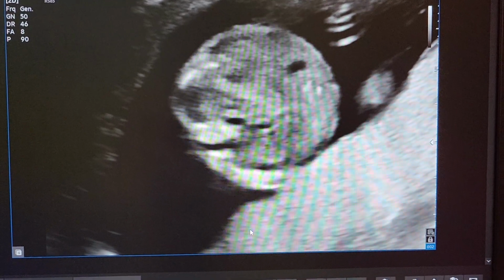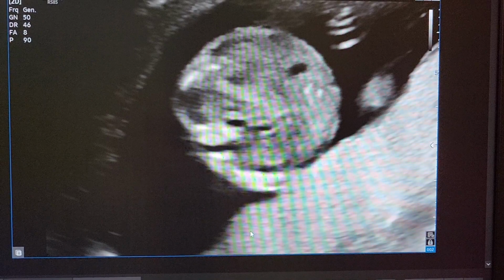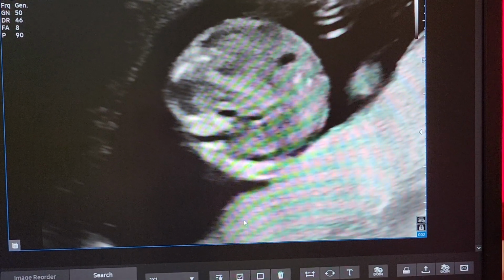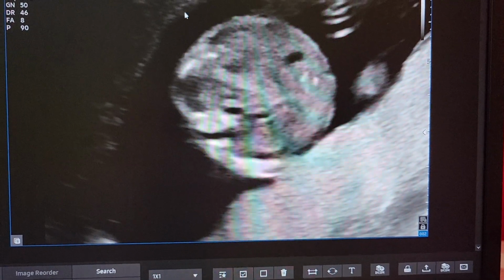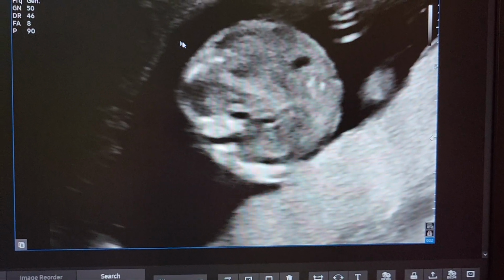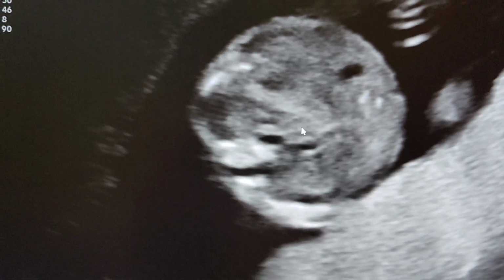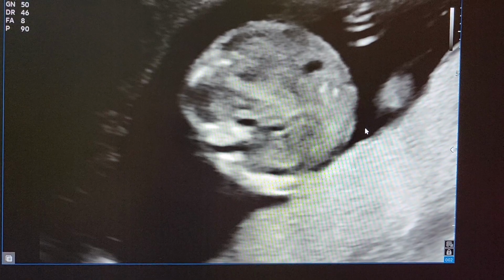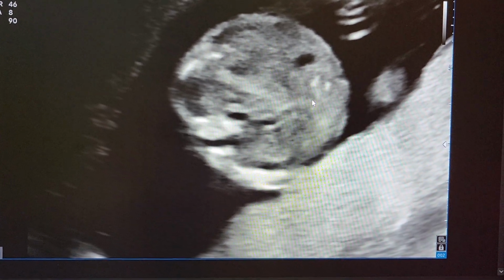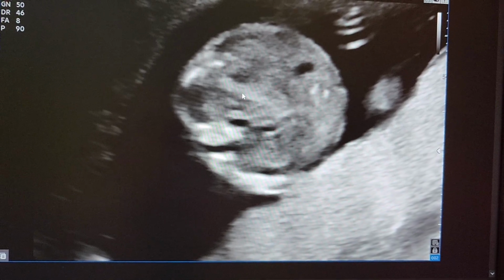As you all know, the first section in fetal echo is the upper abdominal section. Here we have the left side of the fetus on the left of the screen and the right side of the fetus on the right of the screen. After we have determined the left-sidedness and right-sidedness, then we look at the inner structures.